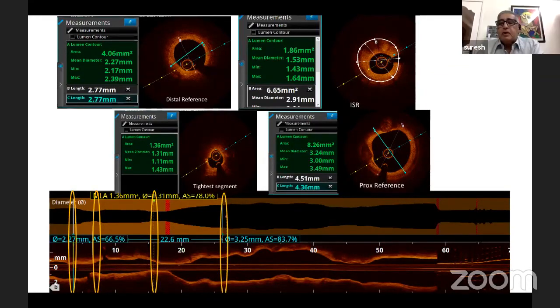Oh, yes, absolutely. And actually, if you looked at the first run of the RCA, the proximal RCA is pretty heavily calcified, so there's not that much luminal encroachment. I thought that might create problems getting the stent down, but that actually didn't interfere at all.